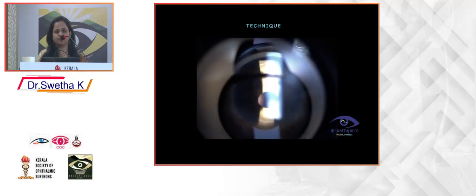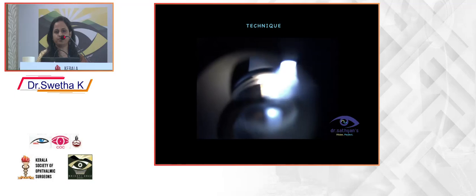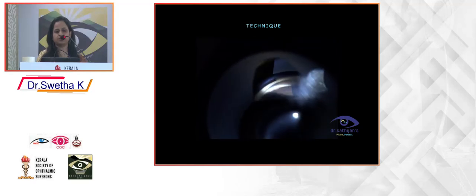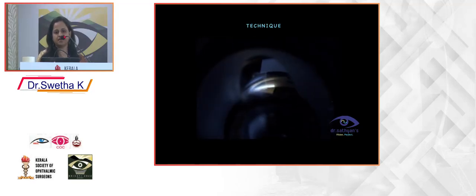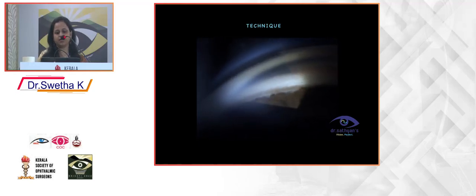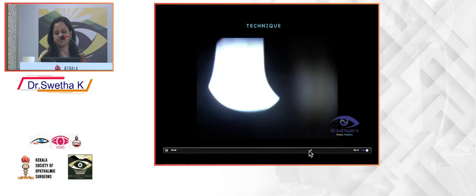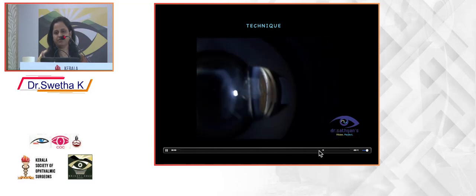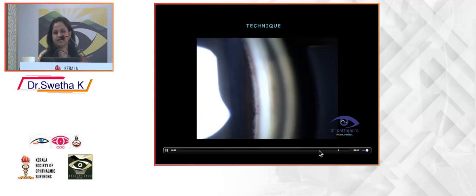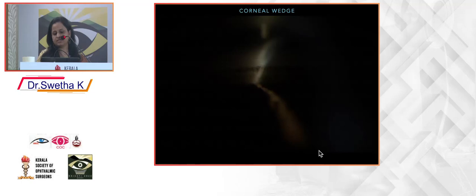The technique of gonioscopy is really important because you have to make sure that the light doesn't fall onto the pupil and constrict it, as that can cause a false opening of the angle. Whenever you see the superior and inferior angle, keep the slit height at minimum, and you can increase the width so that you see just that angle. Whenever in doubt, you can use the corneal wedge technique. When going to the lateral angles, that is the nasal and temporal angles, you have to keep the slit at minimum width and increase the height of the slit. The main thing is you should not allow the light to fall on the pupil and cause a false opening of the angle.